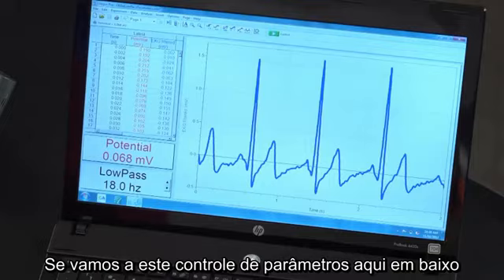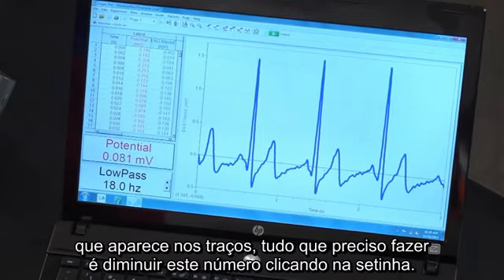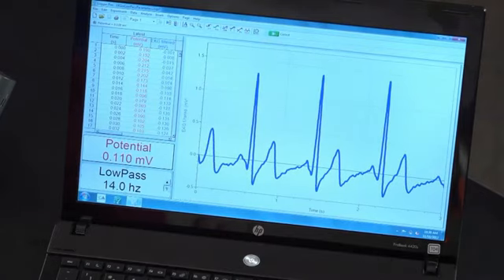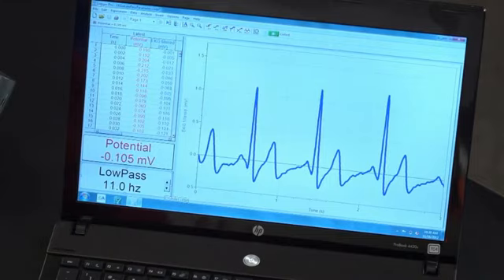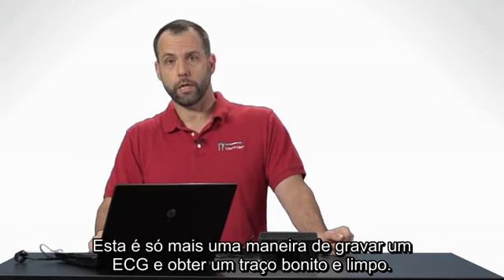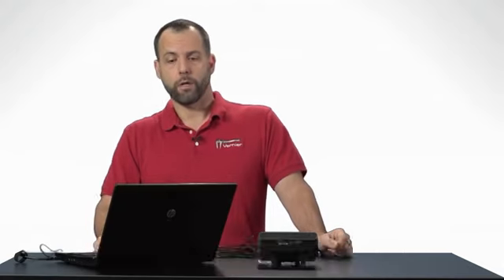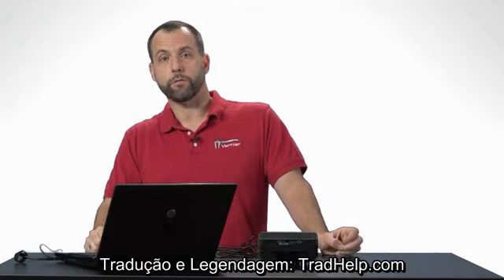So if I go down to this parameter control right here, and if I want to get rid of some of this noise, these little traces, all I have to do is decrease this number by clicking on this little arrow. And you'll see that what it does is it does decrease the peak height, but it also makes the trace look cleaner. And that looks like a nice EKG trace. So this is just another way to record an EKG to get a nice clean trace. And it actually adds some STEM features to it because you can teach your students about digital filters and how to apply them.